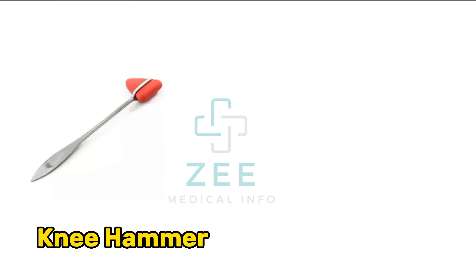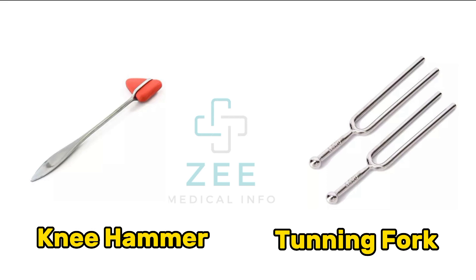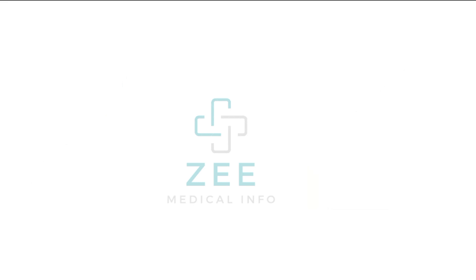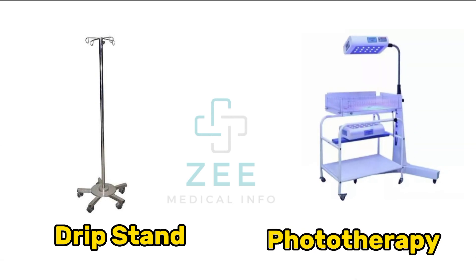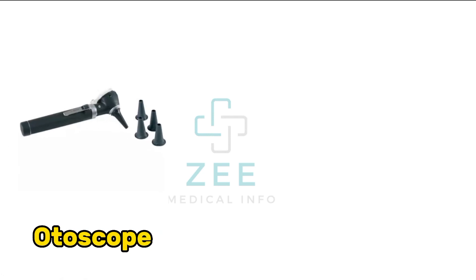Knee hammer, tuning fork, drip stand, phototherapy, otoscope.